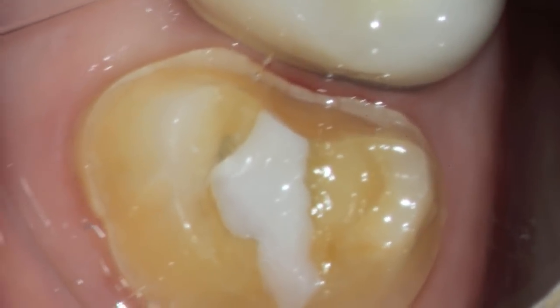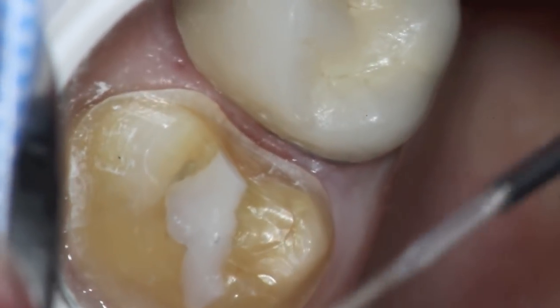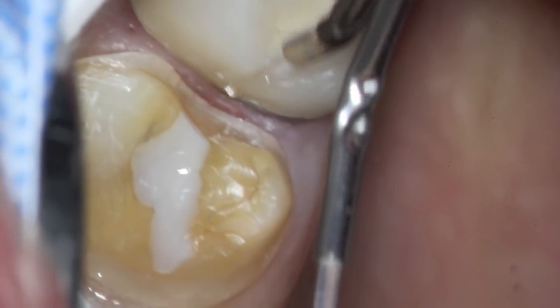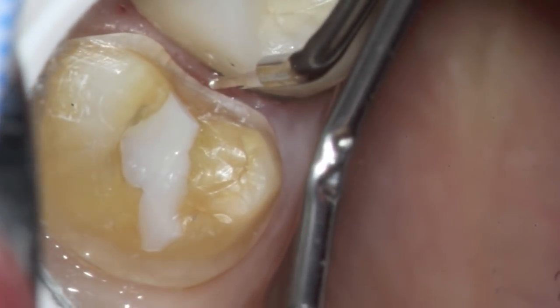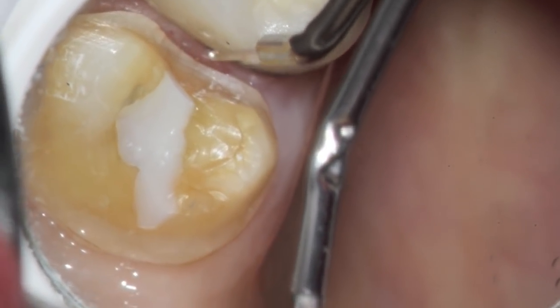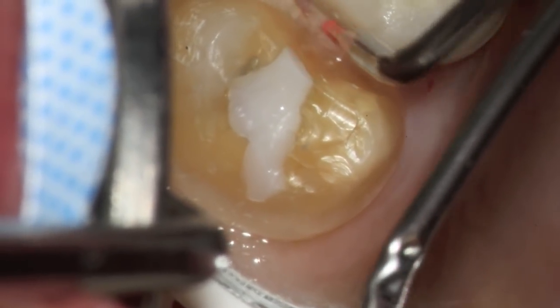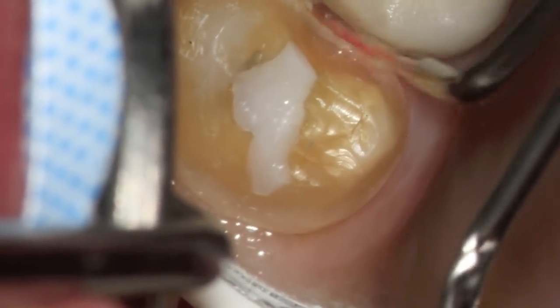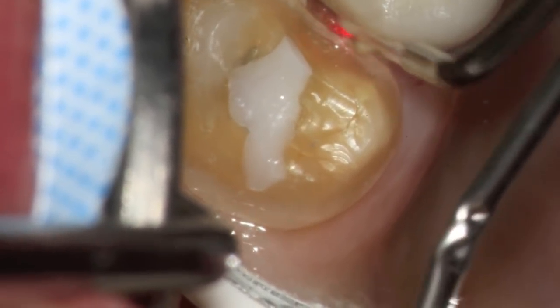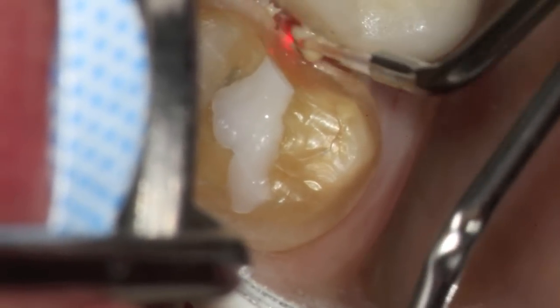This ability to have a dual laser antenna today is truly unique. This is a Zolar laser with a disposable tip, and you can see that it's bent at a 90-degree angle. It allows us to remove gum tissue so that we can get a very clear impression of the margin where the crown meets the tooth. You'll see right there a little bit of smoke, and that's actually the cells disintegrating.